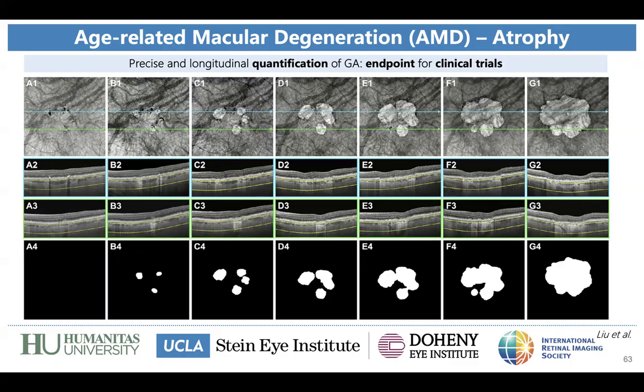There are a few papers, actually, I was looking at them yesterday and today while finalizing the presentation, that compare different slabs of outer retina, RPE, and choroid to detect geographic atrophy. And there can be some discrepancies. So it's very important, in my opinion, to address this point and understand if there are significant differences.